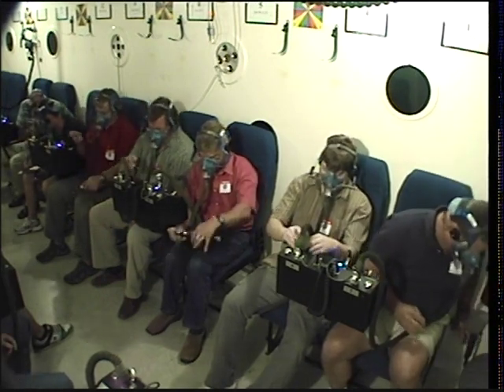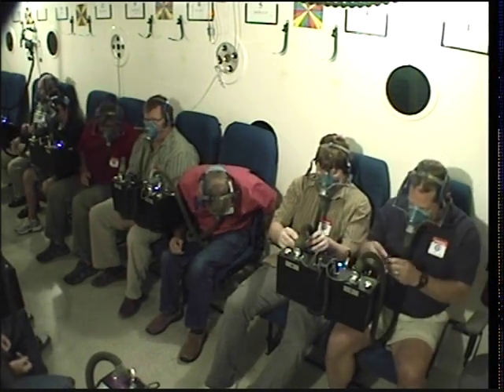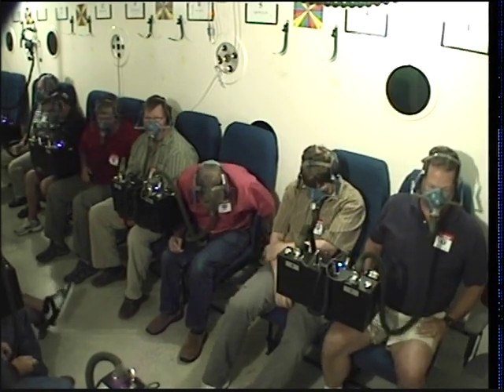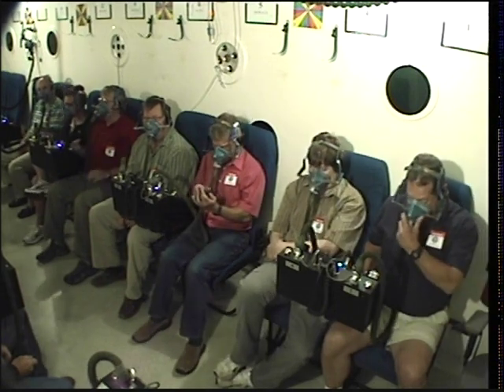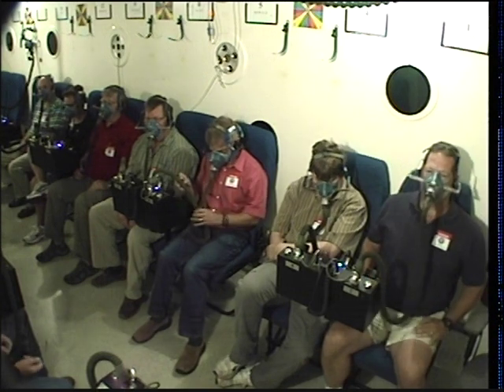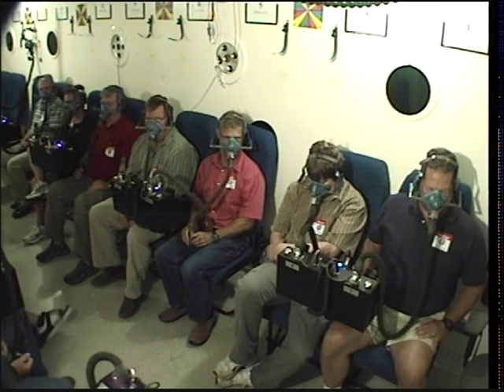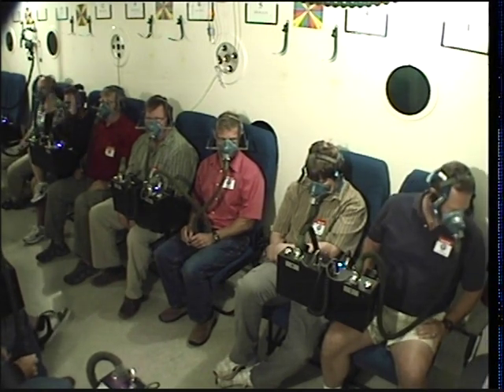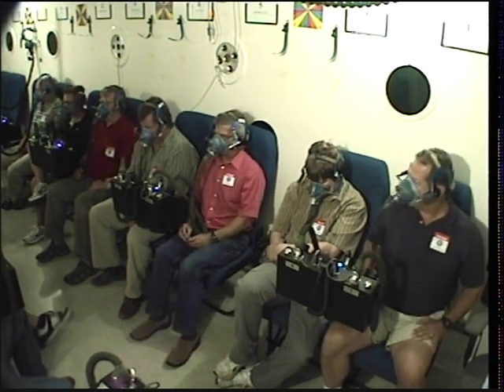We're going to start our descent down towards 18,000 feet. The next demonstration that we're going to do is a night vision demonstration, which will require the use of some color charts, similar to what you see on the wall there. But we will pass those out after we've been off oxygen for about 2 minutes. And as we pass through 22,000 feet, the lights are going to dim for the first time, and we will take our mask off one more time. But we won't do that until we get to 22.